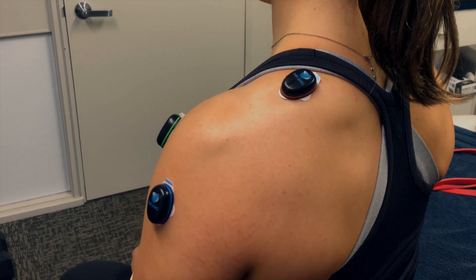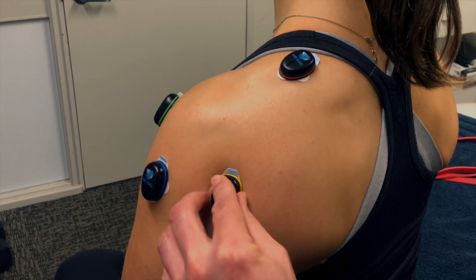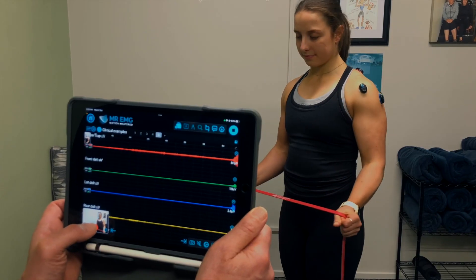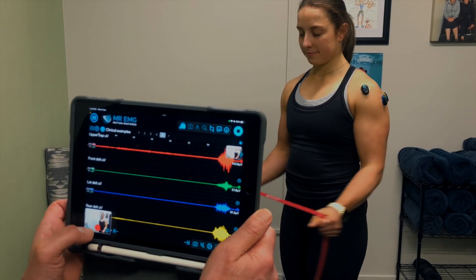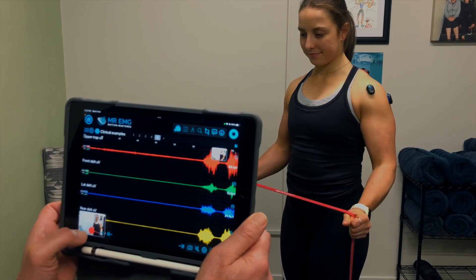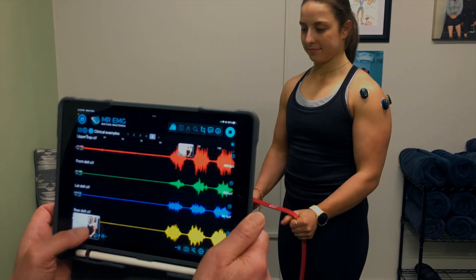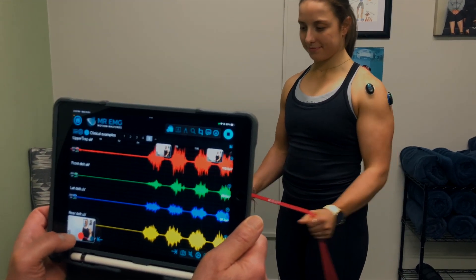Using a resistance band suitable for the patient's symptoms, have them perform 10 resisted shoulder abduction repetitions. Review the amplitudes of the various muscle contractions during this test.